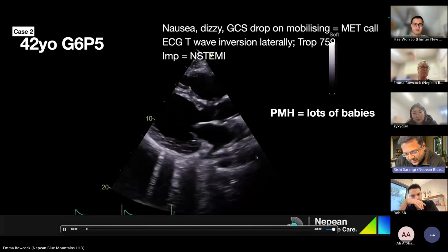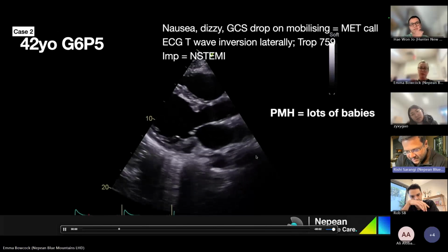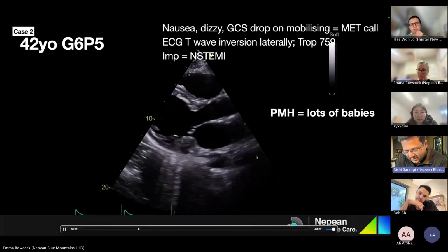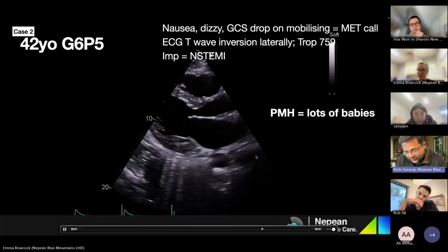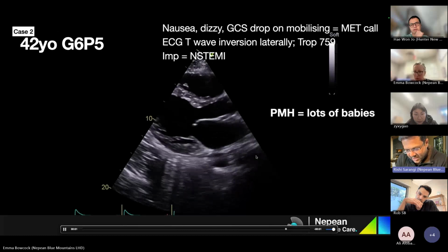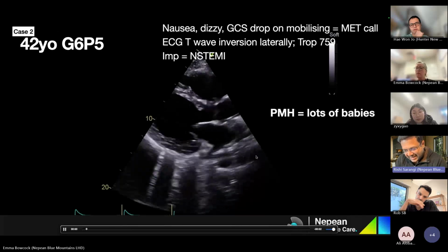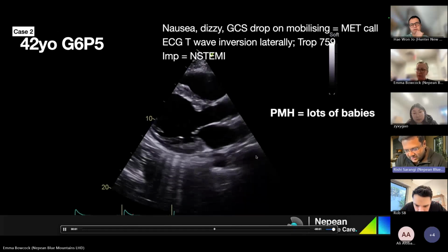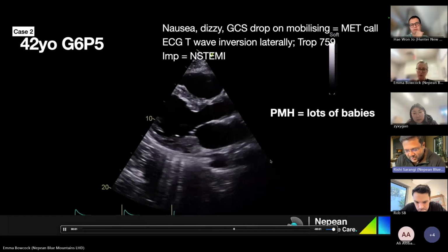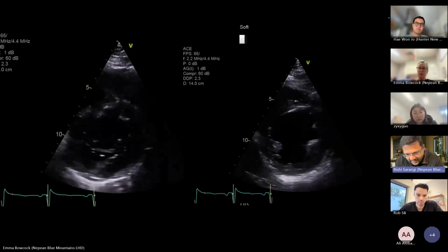Commenting on the LV, the LV size appears subjectively enlarged. LV function appears severely impaired. There appears to be preserved anteroseptal thickening of the LV walls, and infralaterally the base of the infralateral wall appears down. Mild dilatation of the RVOT, aortic root appears normal. LA size appears moderately enlarged. There appear to be prominent B lines in the far field suggestive of interstitial edema.